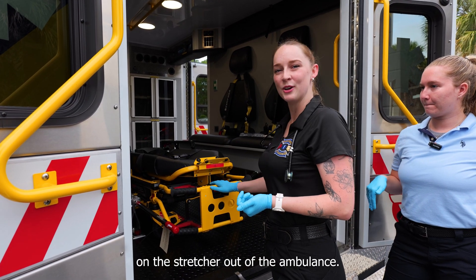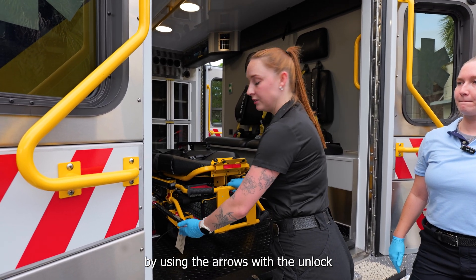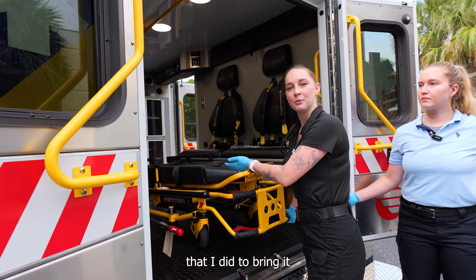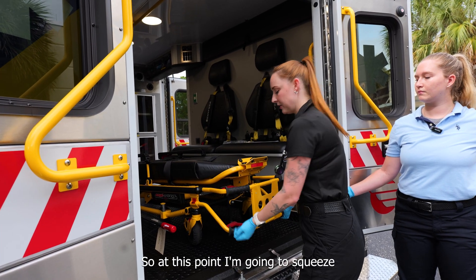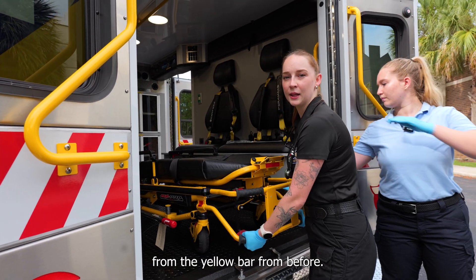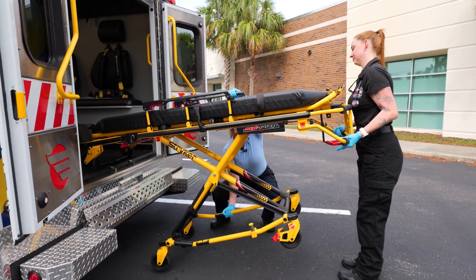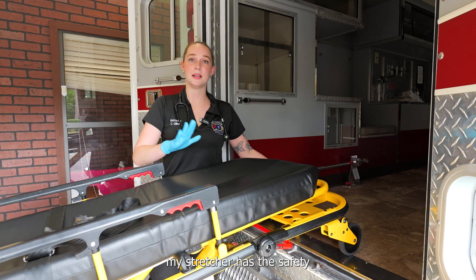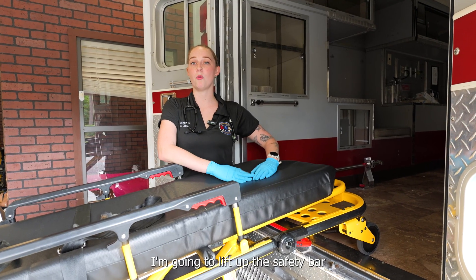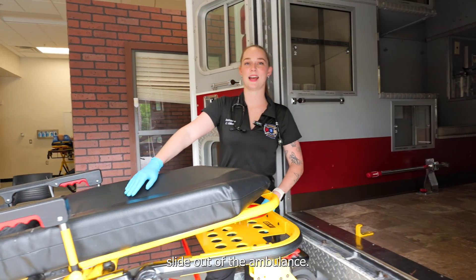Now we get to bring our patient on the stretcher out of the ambulance. I'm going to start by using the arrows with the unlock to release the cylinder that's attached to the stretcher, and then I'm going to do the motions I did to bring it in but just in reverse. I'm going to squeeze and my partner is going to help lower the legs of the stretcher from the yellow bar. Right now my stretcher has the safety and it's connected to the hook. To take it out of the ambulance I'm going to lift up the safety bar from the bottom, bring it up, and the stretcher will slide out of the ambulance.